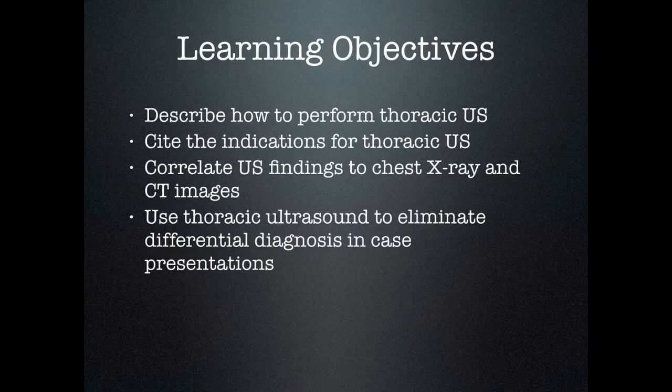Our learning objectives are to describe how to perform thoracic ultrasound, to cite the indications for the use of thoracic ultrasound, and to correlate findings from ultrasound to findings on chest X-ray and CT images. We'd also like to use thoracic ultrasound to eliminate differential diagnoses and case presentations.